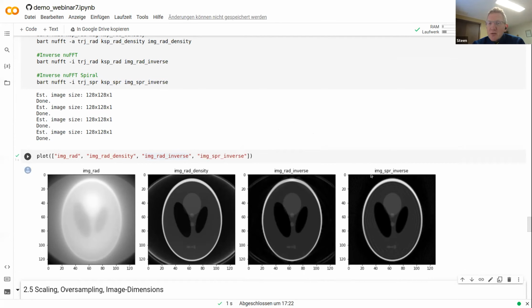I often choose that because if I do 3D reconstructions, I don't want to iterate too many times on it to get the density correction, or even do the full inverse. Are you able to maybe comment a little bit on that? How would you do that, and what is your experience with doing it one way versus the other?